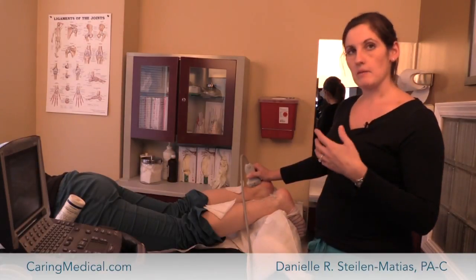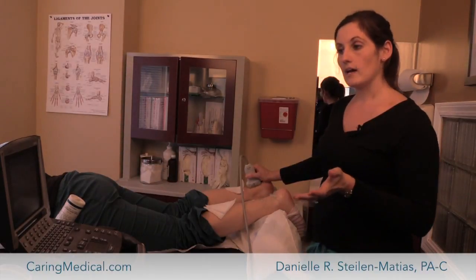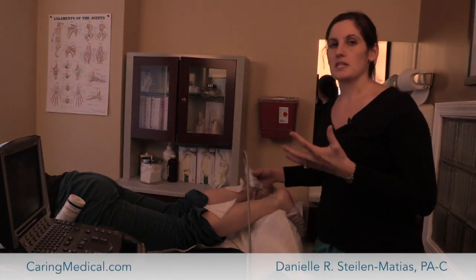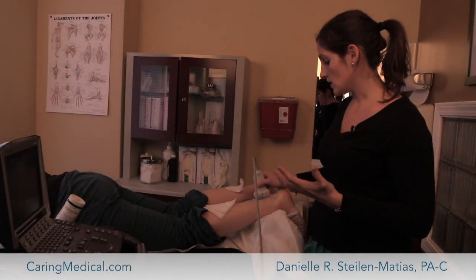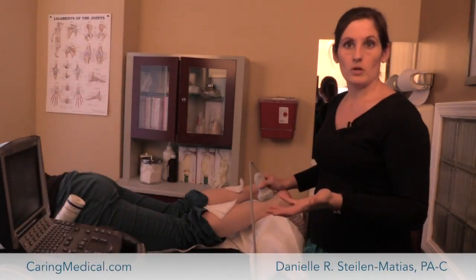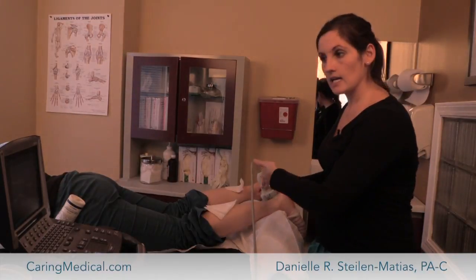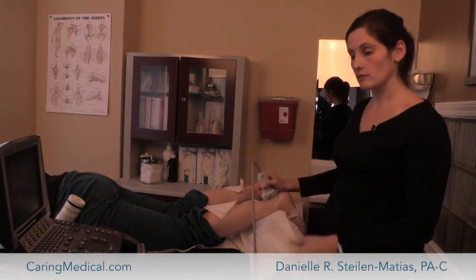Oftentimes what we find is that patients with chronic Achilles pain have degeneration — it's not so much that the tendon is inflamed or that there's a tear, it's just that they're starting to lose cells in the tendon and it's degenerated. So what we'll do is actually do prolotherapy, do injections to regenerate that tendon. And like I said, we can guide it into specific areas that are more injured than others.